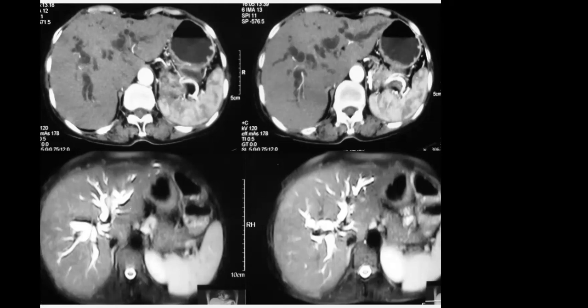So it is actually the nomenclature that changes. When you see a bright structure in X-ray, you say it is radio opaque, whereas the same bright structure in CT scan, you call it hyperdense.